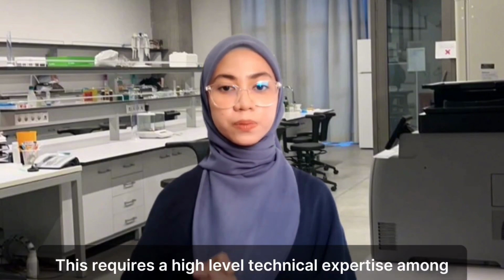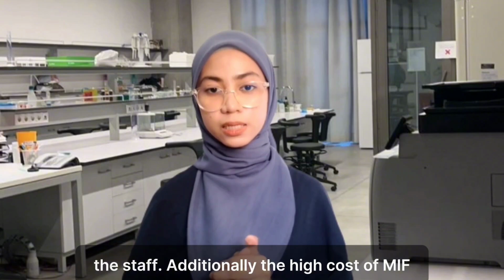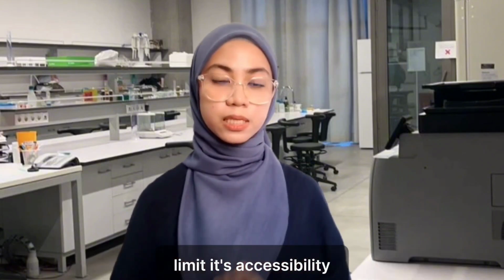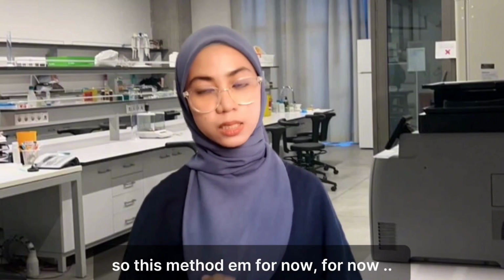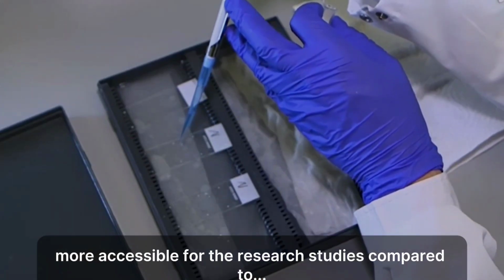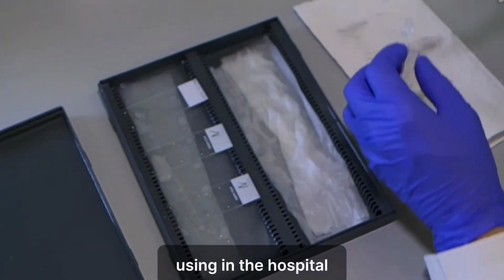Okay, this requires a high level of technical expertise among the staff. Additionally, the high cost of MIF can limit its accessibility. So these methods, for now, are more accessible for research studies compared to use in hospitals.